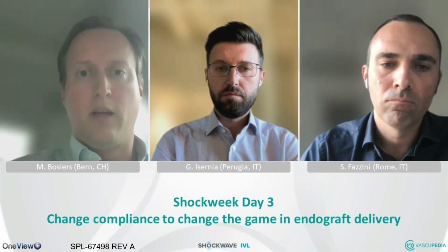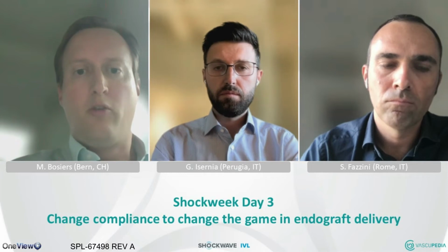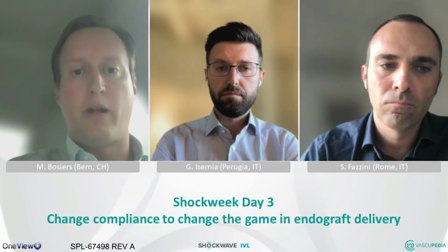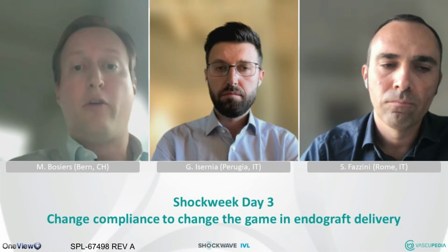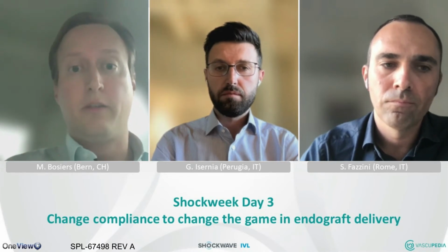Do you fear a kind of rupture or dissection of the iliac, or what is your goal or your strategy in achieving this kind of vessel compliance, to really get your vessel to adapt itself for the large bore device, sometimes up to 28 French?